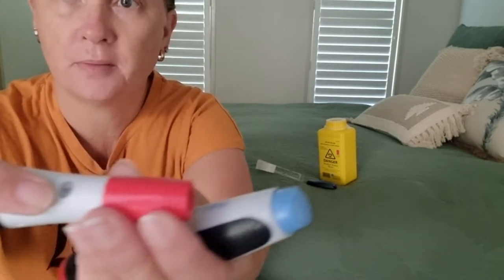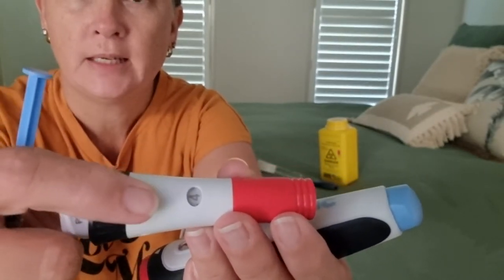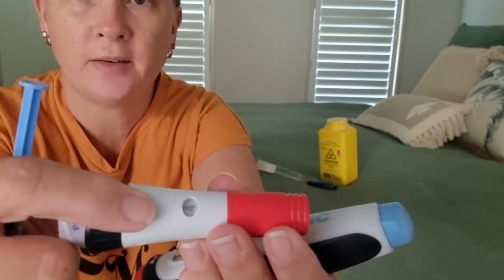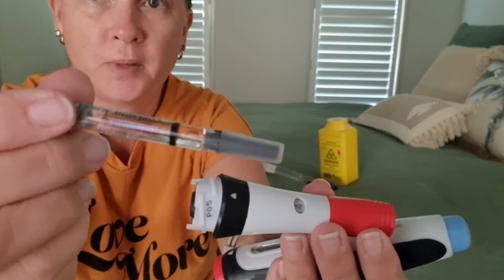Inside the section you've just taken off is the depth marker. We've got it on number four because that works for me. Some people use five; not many people are on six. It can go up to ten, but we don't want to go that far into your tissue — the nurse will explain it.